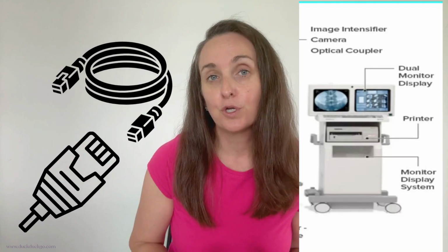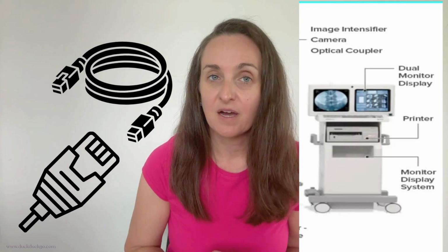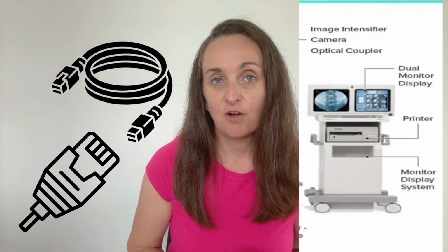speed and accuracy when available. Just note that if you are pulling it up from the patient information from a scheduled work list, that you must have a reliable Wi-Fi compatible monitor or use an Ethernet cord that attaches from the back of the monitor to an Ethernet outlet in the OR that will send the x-rays from the monitor to the PACS server.